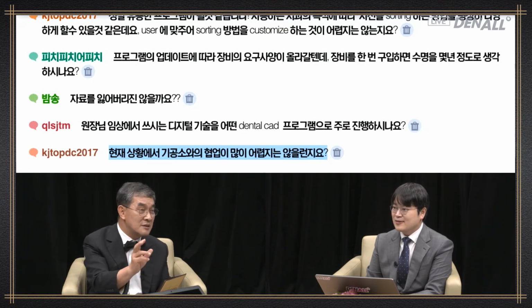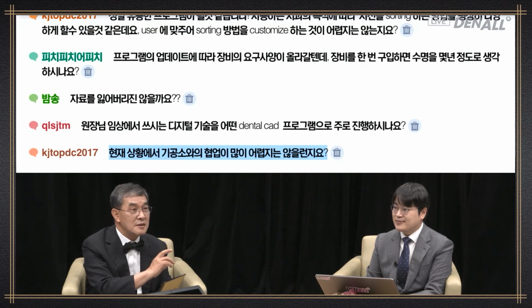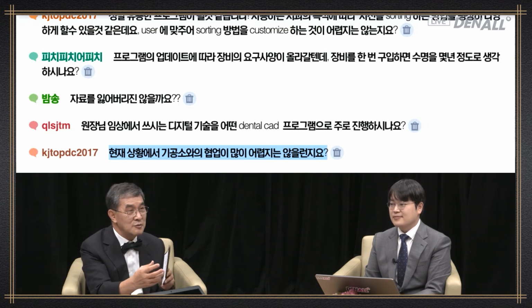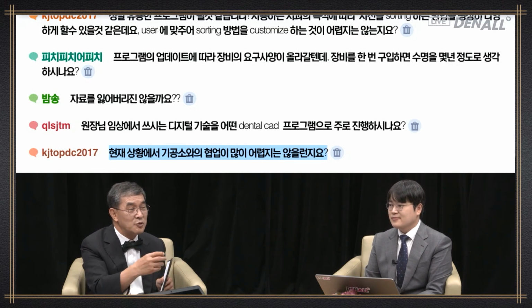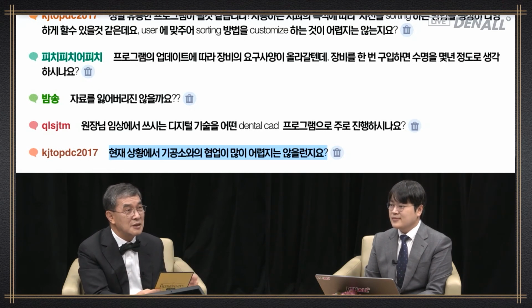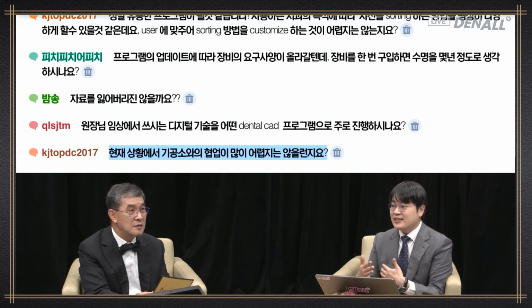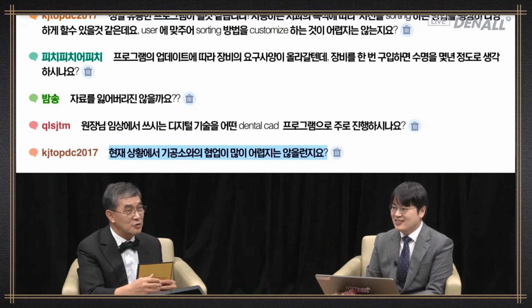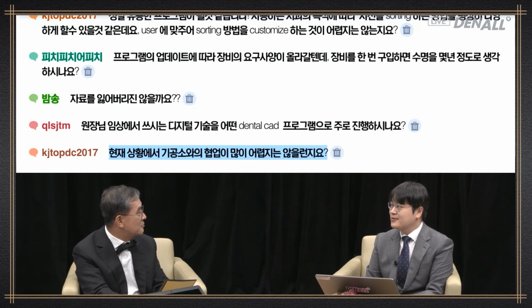So you can find a lab skilled in digital approach, and you can communicate with the lab using compatible programs. It will work, right? I believe that will work. We don't have to have face-to-face communication, so we can do it online. So if the program is compatible between the systems, the communication can be facilitated.